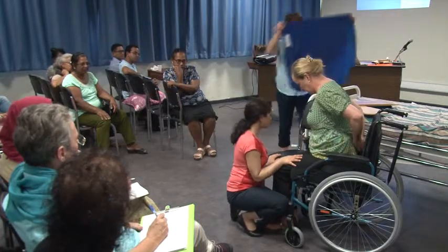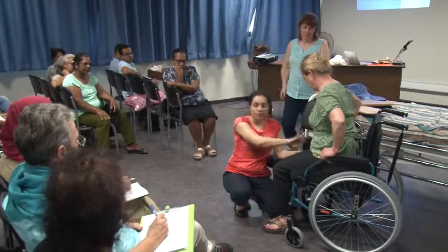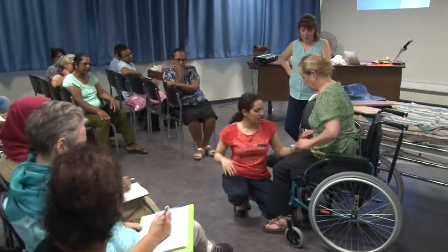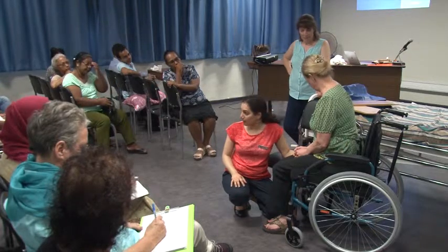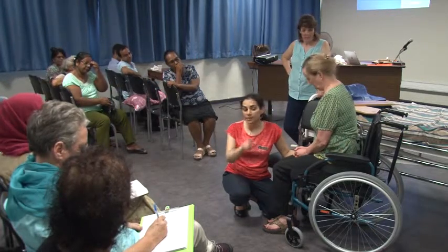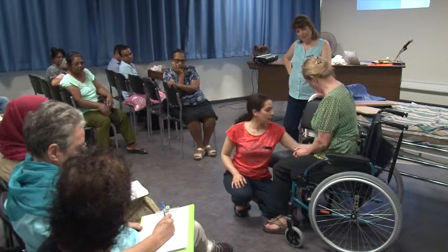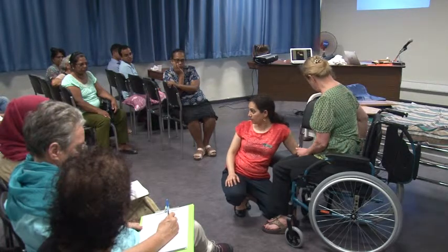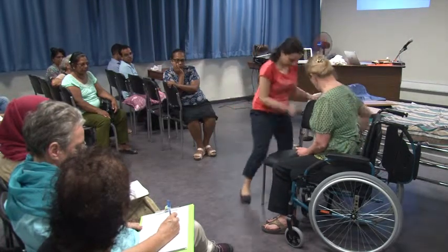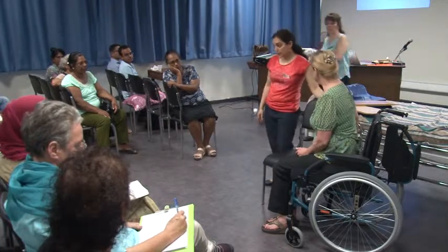So in this maneuver, what you want to do is you want to protect the skin at all costs. You don't want the skin to hit anywhere during the process. You would take the armrest out. Again, if you can't take the armrest out, I wouldn't suggest this transfer. Right? Armrest out. You want to miss the wheel completely. Right? That is here. And make sure the brakes are on. Good. Miss the wheel completely.